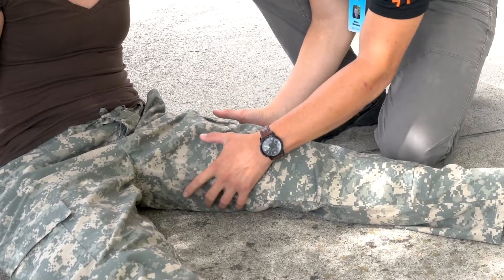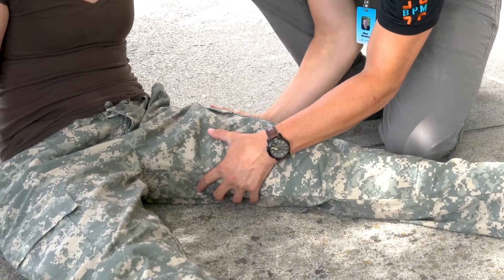The indication for traction splinting is an isolated mid-shaft femur fracture, which is a fracture in the middle third of the femur bone with no other injuries proximal or distal to the fracture. Carefully inspect and palpate the entire injured extremity while asking your patient if they are experiencing pain or any other sign of injury in any part of the affected extremity. The reason traction splinting is contraindicated in anything but an isolated mid-shaft femur fracture is that the force of the splint may be sufficient to cause further damage to any other injury in the extremity.